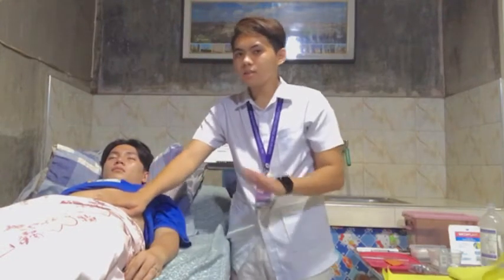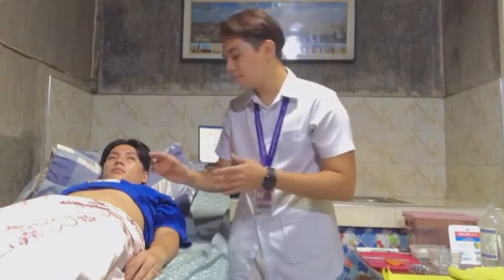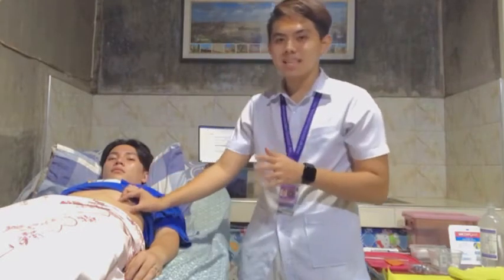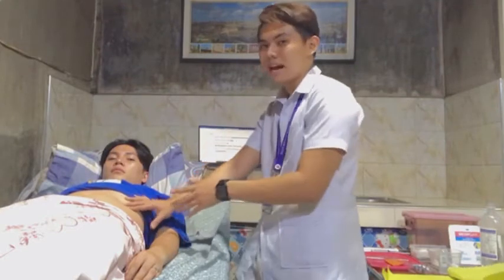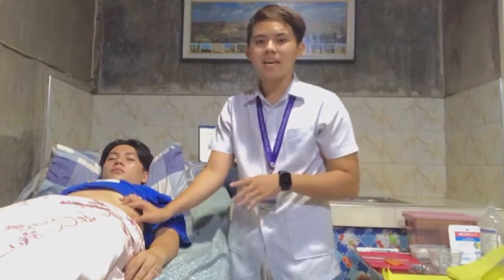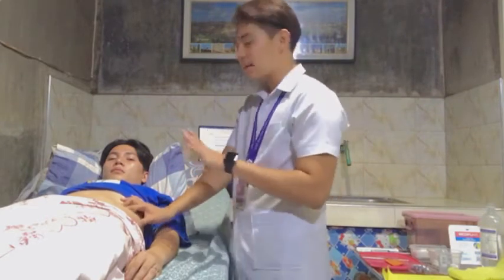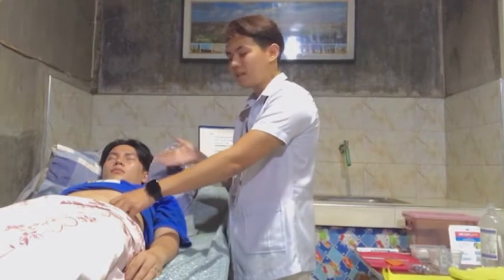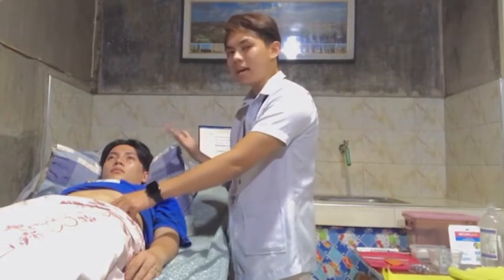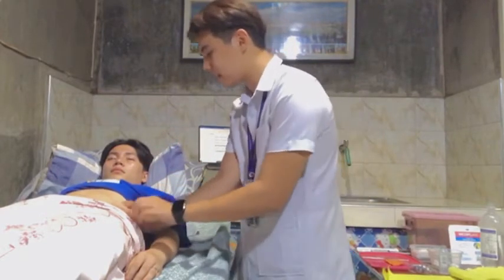Okay, so for us to make sure that you have the right size needle, of course, we need to use your thumb and forefinger to grasp a skin fold of tissue at the injection site and measure the fold from top to bottom and check to ensure that the needle is about half as long, because cushioning and subcutaneous tissue help ensure the needle enters the areolar connective tissue. As you do this, look at the patient's facial expression so you can identify if the patient has any tenderness, masses, or pain.